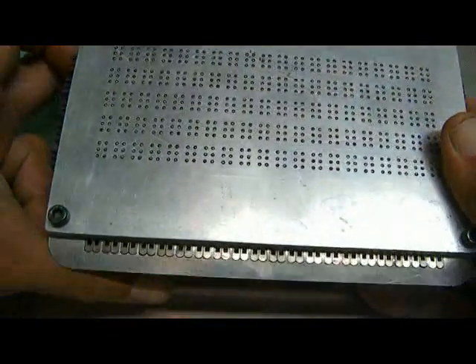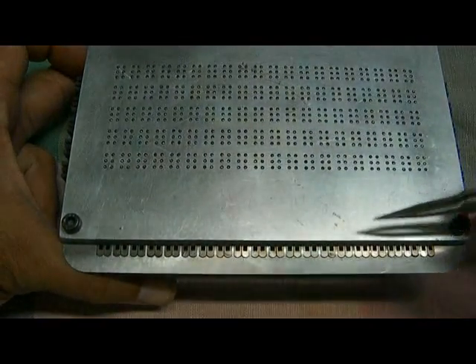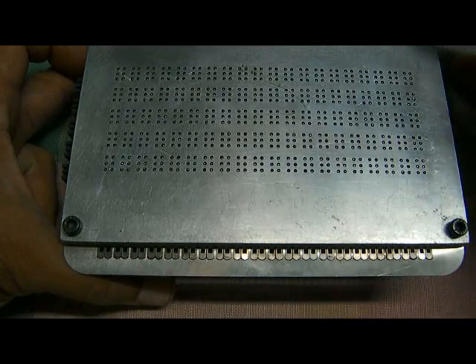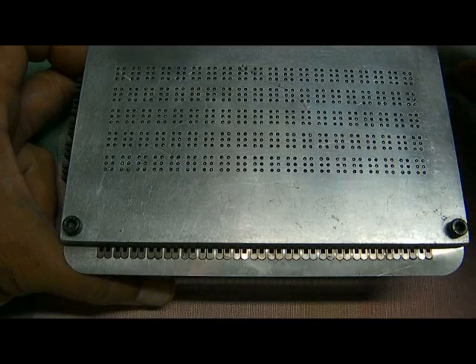What I've done is I've enabled all columns. These columns are all enabled over here, as you can see. The movement, if you look at this first column, it's completely enabled. There's a little bit of movement over there.